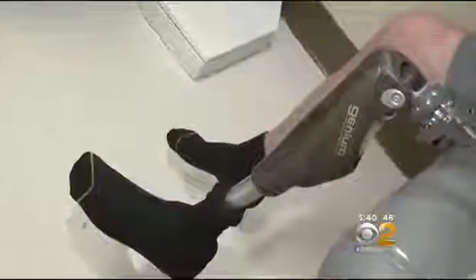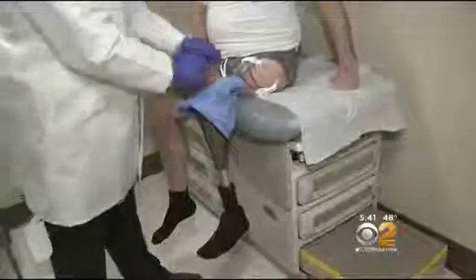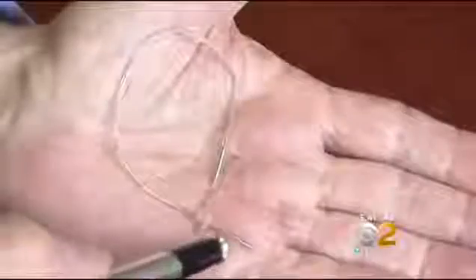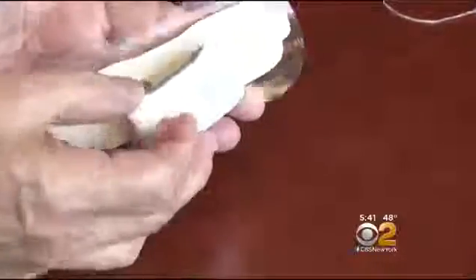His missing leg hurts. My mind is saying, yes, you have pain there, even though I don't have that part of my body anymore. I felt like my ankle was broken or my toe was twisted. Nothing gave Matthew much relief until he came to see Dr. David Spinner, Director of Pain Management at Mount Sinai, who decided to try a new pain blocker called a Bioness StimRouter. It's a tiny electrode, a small transmitter, and a controller that pulse small electric pulses into the nerves carrying the pain signals.